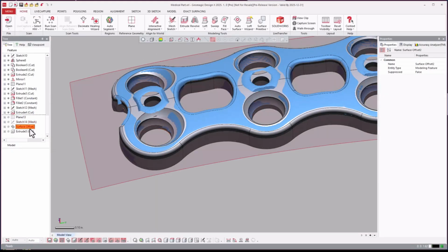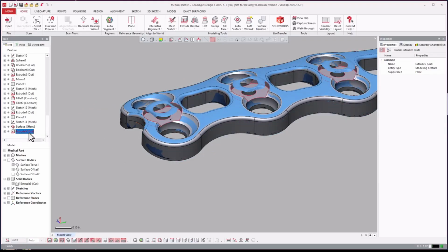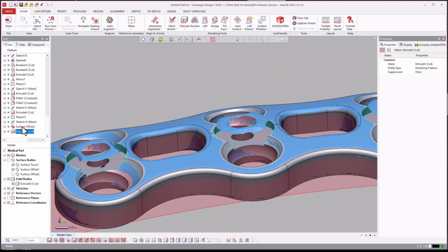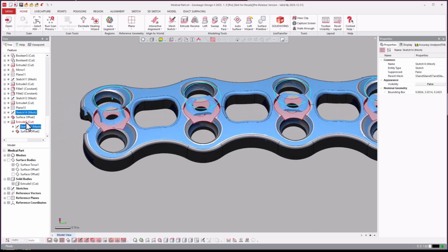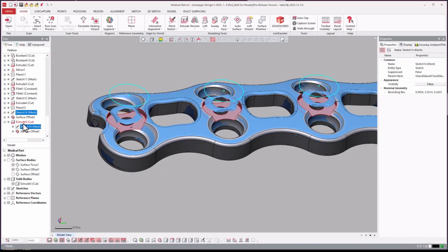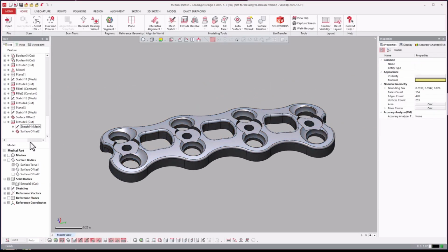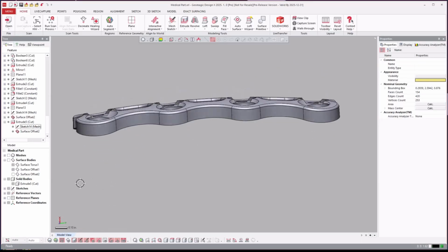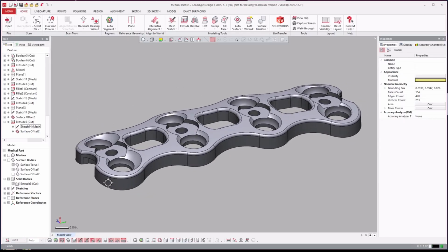Let's see what that surface offset was. Offset that down. Oh, yeah, so they countersunk all of these by doing an offset surface down and then using this sketch here and drawing those from that perspective and cutting that up to surface. And then we'll go ahead and turn it off, and there you go. You created this beautiful part that's going to screw bones back together, I think. I'm not positive, but it's a really neat application there.